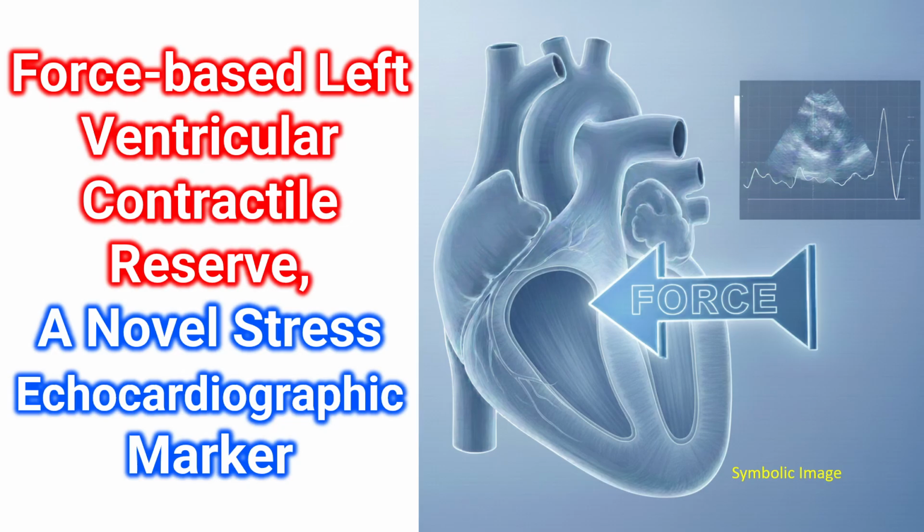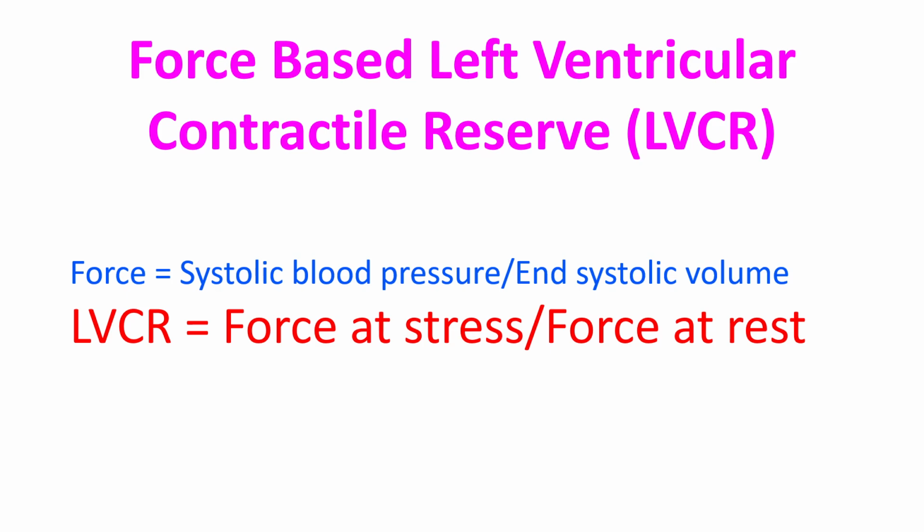Stress could be either exercise or pharmacological. Left ventricular ejection fraction unmasks latent left ventricular dysfunction that may not be visible while the patient is at rest. But left ventricular ejection fraction is dependent on preload and afterload, that is related to ventricular volume and blood pressure. The newer, more robust echocardiographic marker is force-based left ventricular contractile reserve.